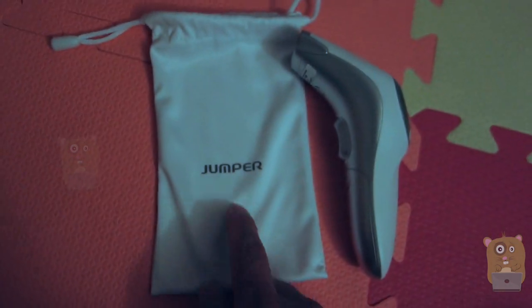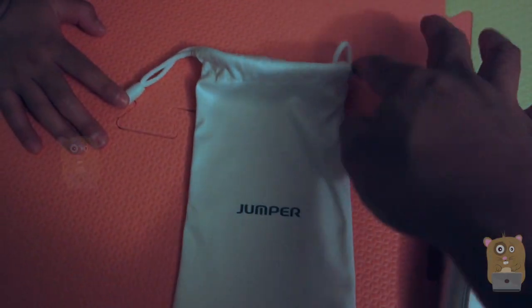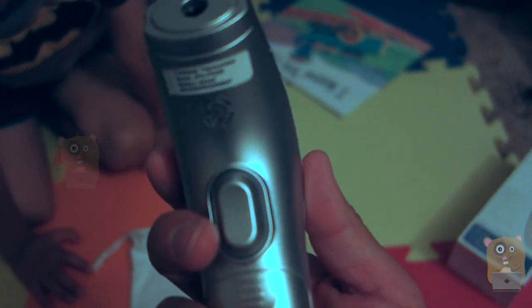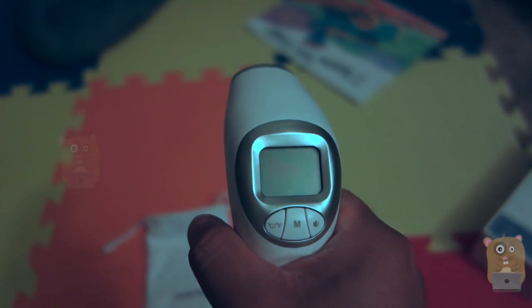It also came with this little carrying pouch with a drawstring. Here's the unit. Where this unit has a trigger over here — just press that and it'll turn on.